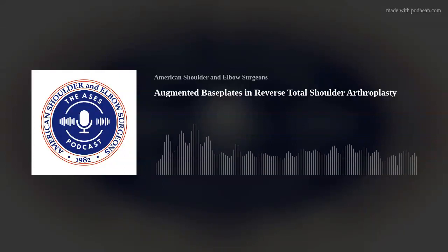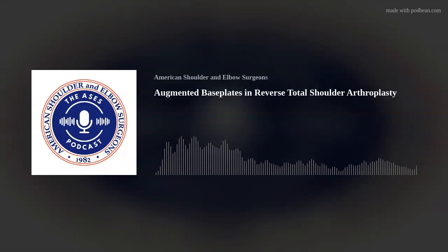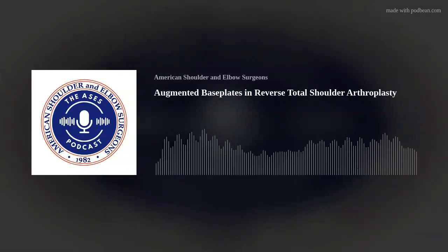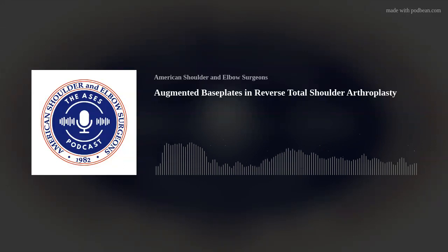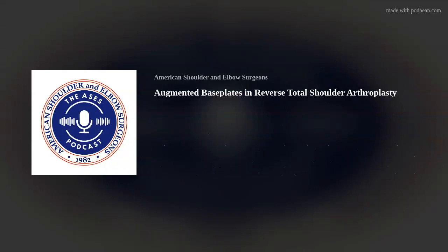These patients have really soft bone because they haven't seen a lot of force, and so I won't ream as much. I'll try and get with my base plate 50-60% coverage. Fixation is key. So that's how I'd approach that. I do go a little bit bigger to try and minimize instability. I try not to go so tight to minimize stress fractures, but that's sort of a simple overview.